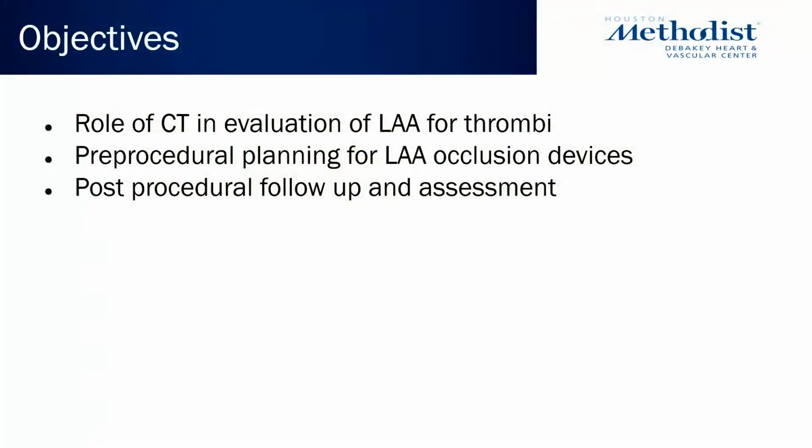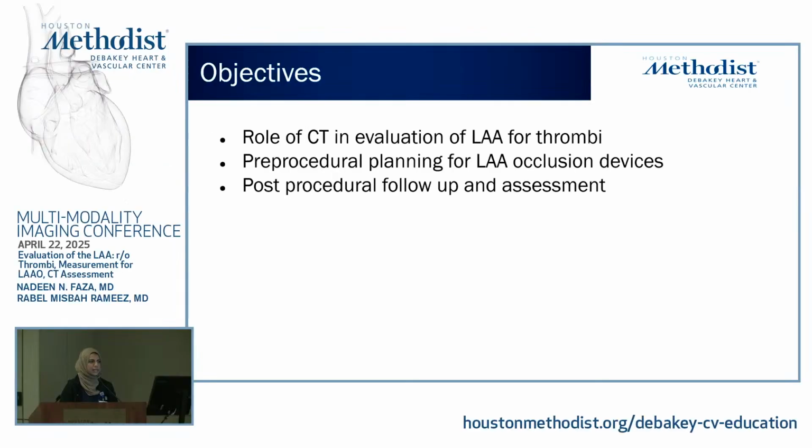I have no disclosures. My objectives are quite brief, but this is quite a broad topic. Looking at the role of CT in the evaluation of left atrial appendage thrombi, and then its role in the pre- and post-procedural space. And then if we have time, we'll also look at some cool intraprocedural CT images.